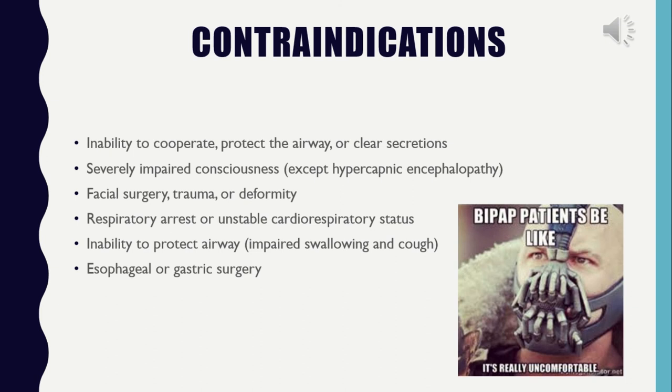So there are some contraindications for the use of a BiPAP machine. Of course, inability to cooperate and protect the airway, or they are unable to clear their secretions. Any severely impaired consciousness, except of course hypercapnic encephalopathy, if it's prescribed by the physician, he will give you the order for BiPAP. Any facial surgery, trauma, or deformity that doesn't allow you to create a good seal with the mask. Of course, respiratory arrest or unstable cardiorespiratory status. We would be at that point coding them and intubating them.